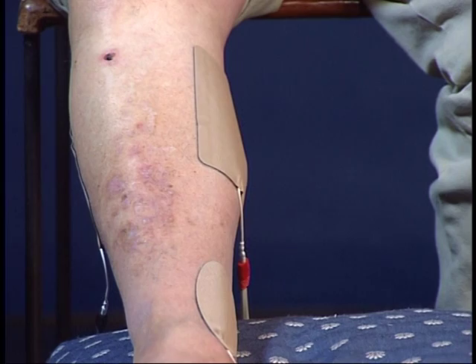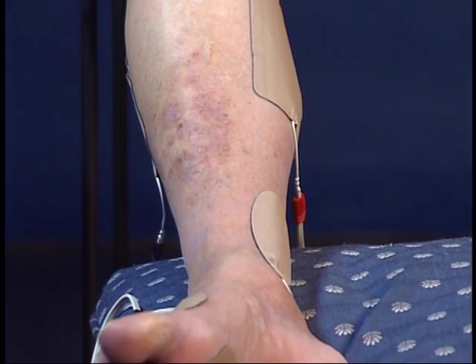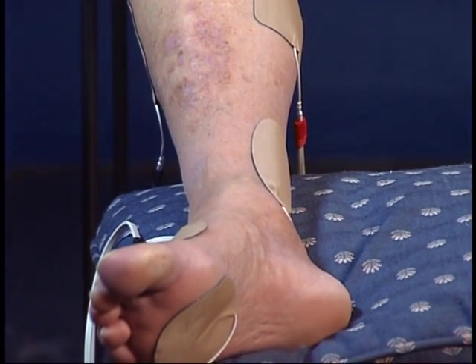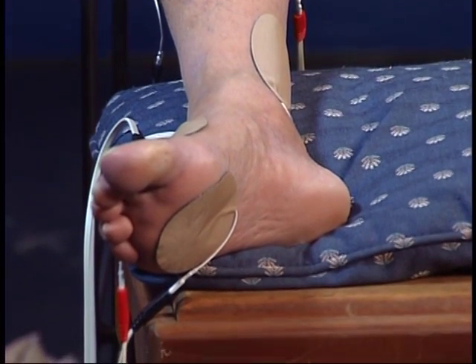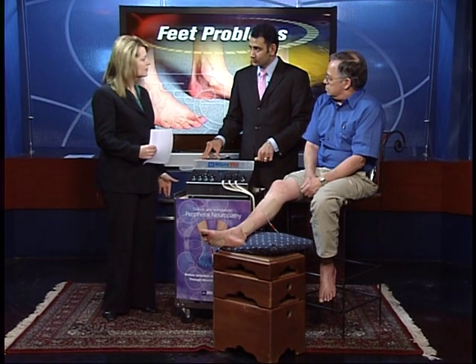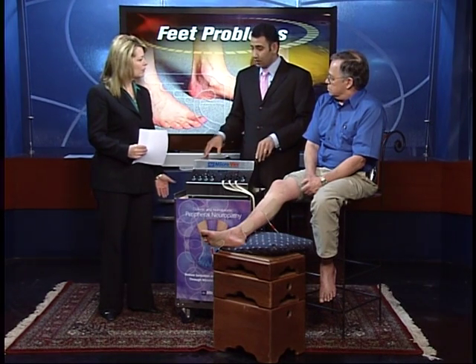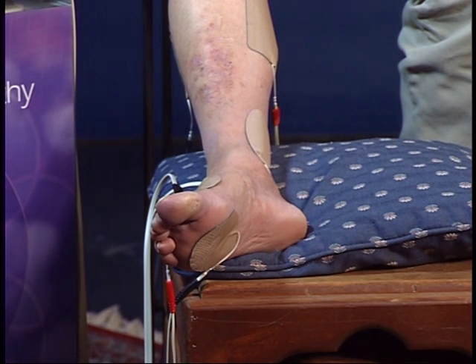Are you sending currents individually or all at once? It is individual in different locations, but it is simultaneous. So if you send one to his foot, will the muscles down there contract separately? They're contracting as well, yes. A lot of it you can't even see — it's only when you turn it way up that the contractions are quite visible. It feels kind of good — almost like a rapid massage that pulses on and off. This is similar to what they put on you in the hospital after having a baby to avoid blood clots. That device inflates to prevent blood clots and moves blood similarly, but this gets deeper into the deep tissues, whereas that is more on the surface.